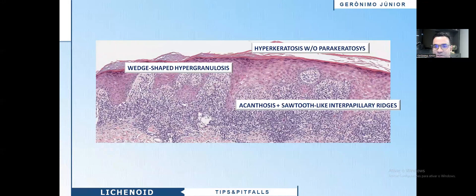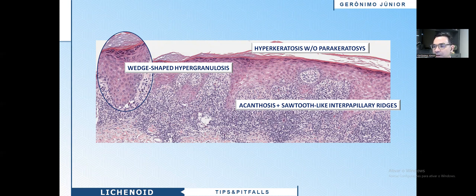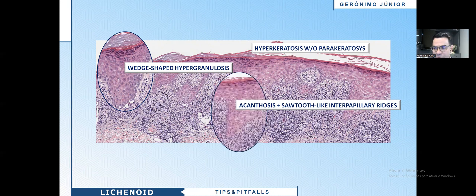In our case, we see hyperkeratosis without parakeratosis, hypergranulosis — you see here a wedge shape of the granular layer — and the epidermis is hyperplastic with sawtooth-like interpapillary ridges, as you can see here.